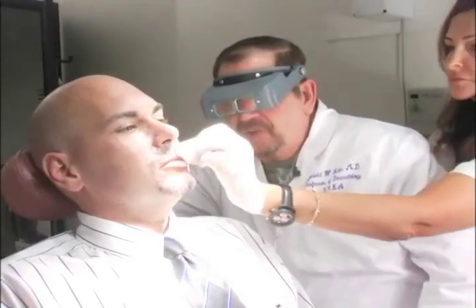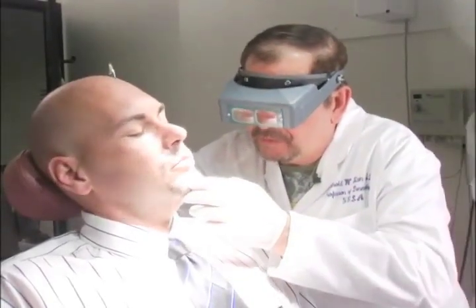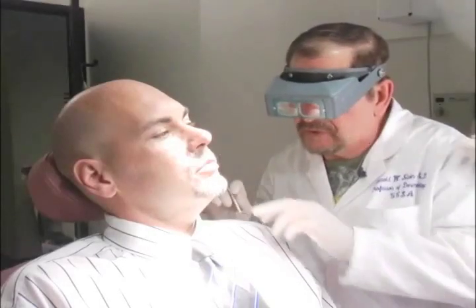Now what we want to do is build our flying buttress up in the corner of the side of the mouth. And what we do is we pull firmly against his face right here, and we build a little bit of a flying buttress with serial puncture. And I believe it's a little more lateral, you see, because I need this. Now, can I have some dry gauze to dry that out?